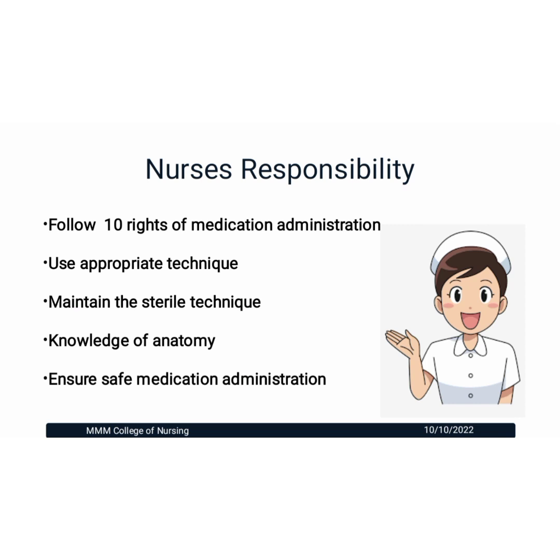The nurse's responsibility when administering IM injection is to follow the 10 rights of medication administration, use appropriate technique, and maintain sterile technique throughout the procedure. Knowledge about anatomy is highly required to prevent nerve and vascular injuries and ensure the medication is administered safely to the patient.